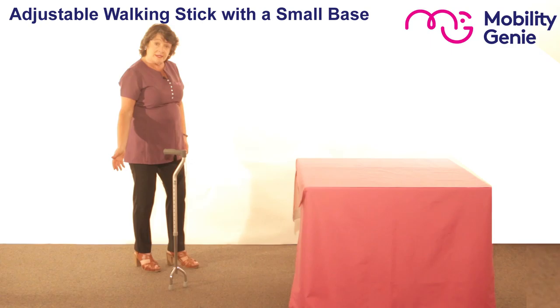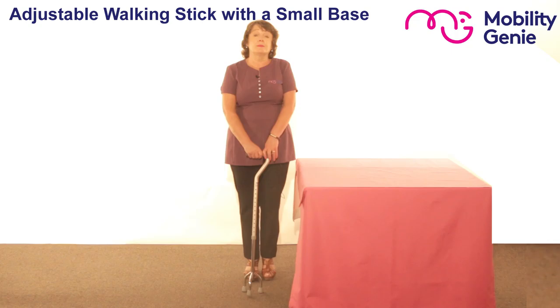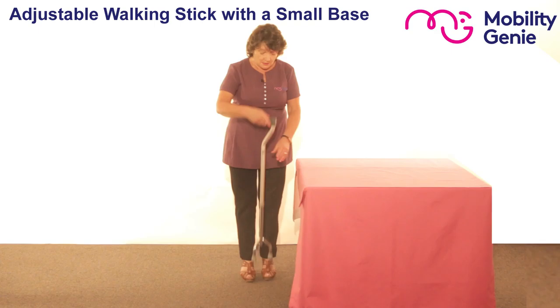So how is it different to a walking stick? When I let it stand on its own, it stays standing, and as I walk into it, it gives me additional support that a walking stick wouldn't. It's usually recommended by your physiotherapist or your occupational therapist, or if you find that a stick is no longer suitable to you.